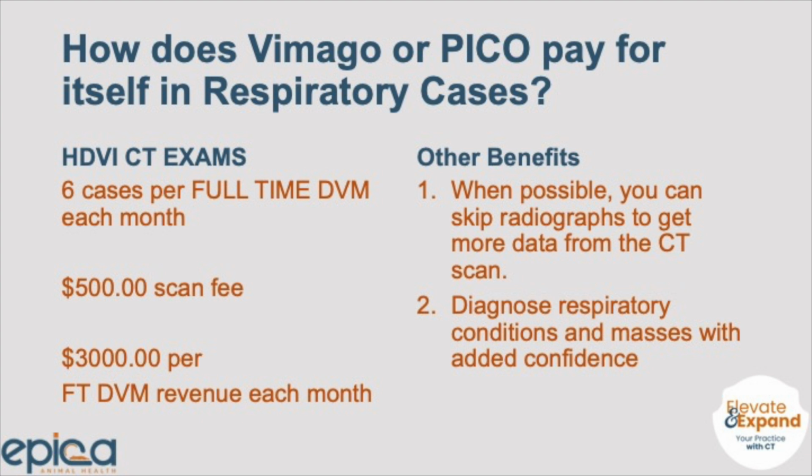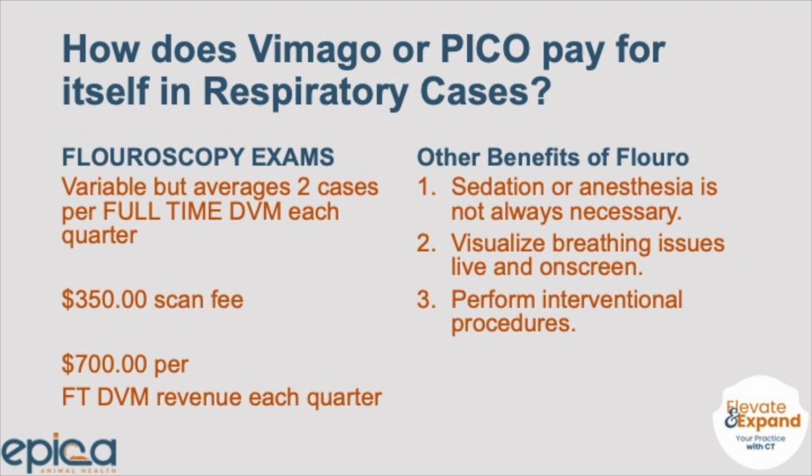Other benefits would include your ability to just skip radiographs. You don't have to use radiographs anymore to diagnose chests. You can go straight to the CT to do this, and you can get far better results than what you've been getting with radiographs. Another benefit, of course, is you're going to be able to diagnose these respiratory conditions and the masses and all the little things, the nodules that come with them, with much more confidence.